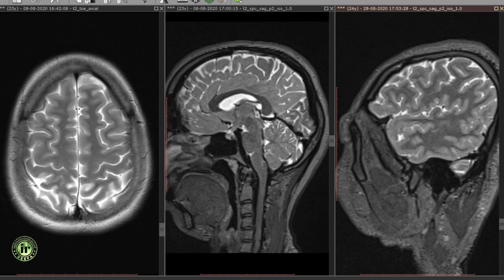The parieto-occipital fissure separates the parietal and the occipital lobes. The sylvian fissure separates the frontal and parietal lobes from the temporal lobe inferiorly.